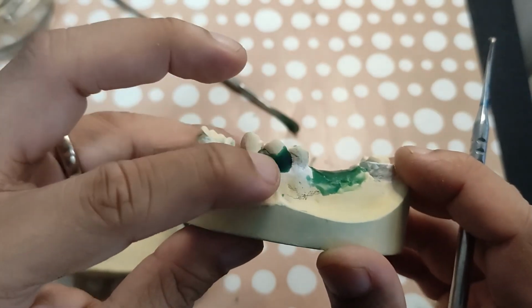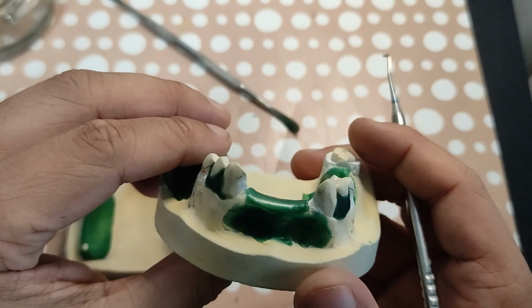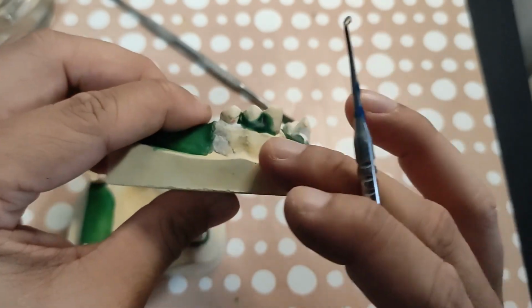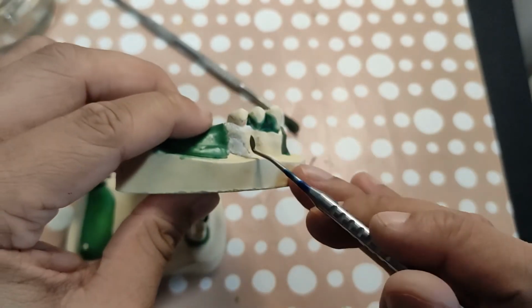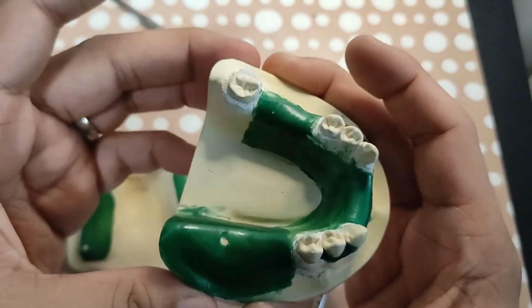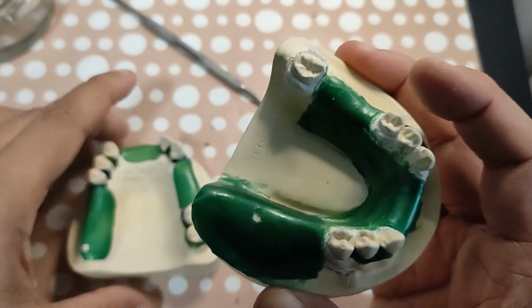So the arbitrary blockout will provide ease of removal when you do impression taking for this cast, right? So arbitrary blockouts again here, arbitrary blockouts there para madaling matanggal when you take an impression. Okay, there's a parallel blockout here, right? And that's the lower. Also your tissue stop is right there, your rest cast stop.